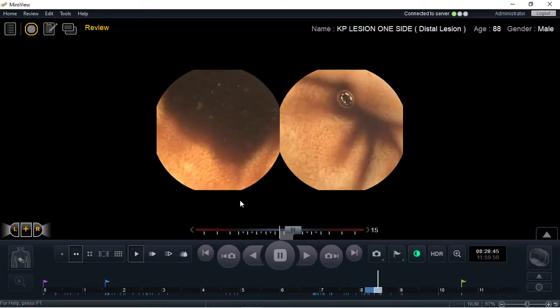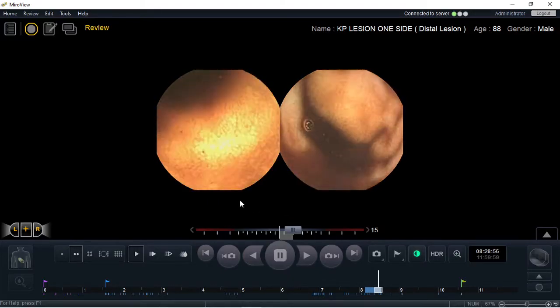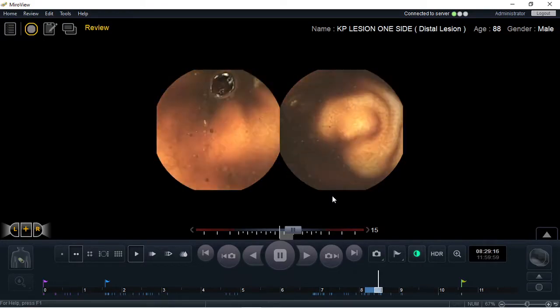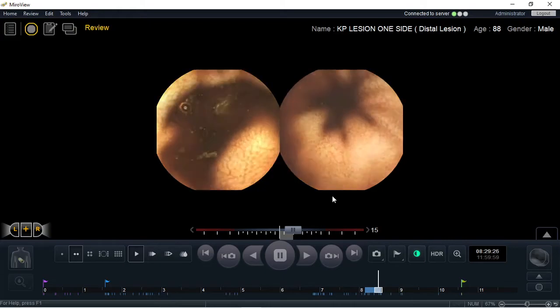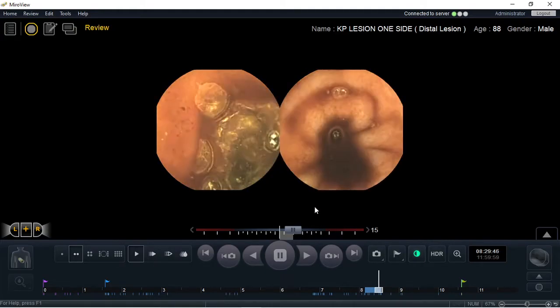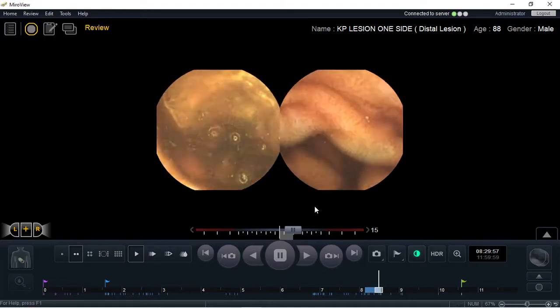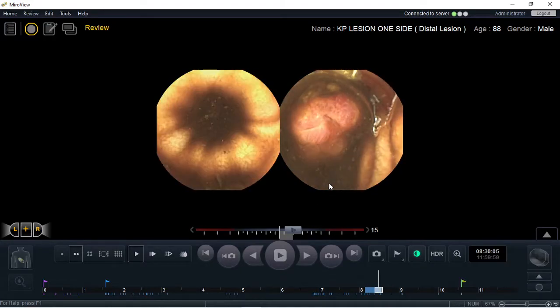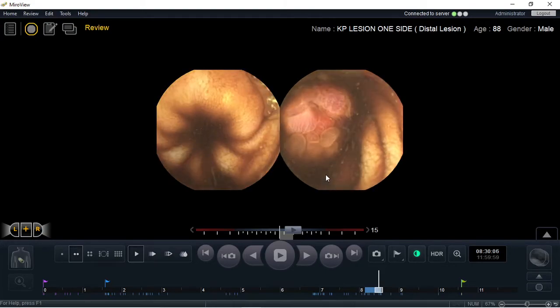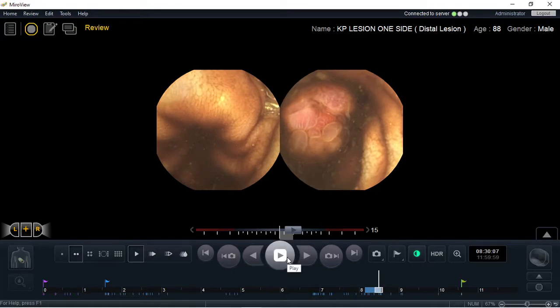As you see on the left-hand side, normal small bowel mucosa. And on the right-hand side, very shortly, there will be a large polypoidal lesion, which is only identified by the right camera. As the camera migrates through, the left-hand side remains normal, showing how a capsule can clearly miss lesions depending on the direction the capsule is facing.